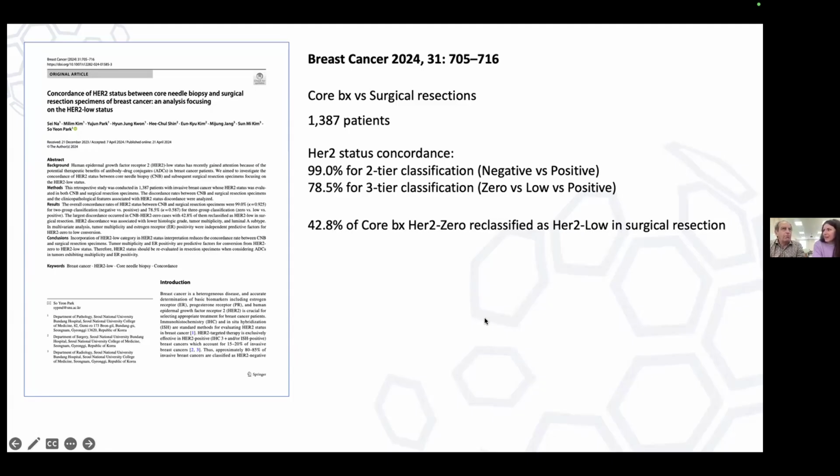Proportion will be really difficult in some cases because we have this cutoff point of 10% in many of these categories. Sometimes it is very obvious, much less than 10% or much more than 10%, but sometimes it could be 10%, could be 11, could be 9. And obviously in a big section there will be some imprecision, but the number of cases that are so difficult for percentages will be very low.